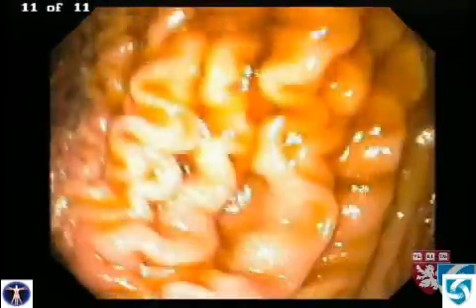In this patient, the typical 3 choices appear at the Y anastomosis, and the correct route to the papilla must be selected. It is often the most difficult of the 3 options.